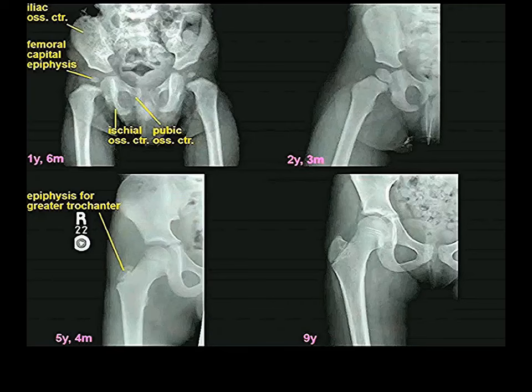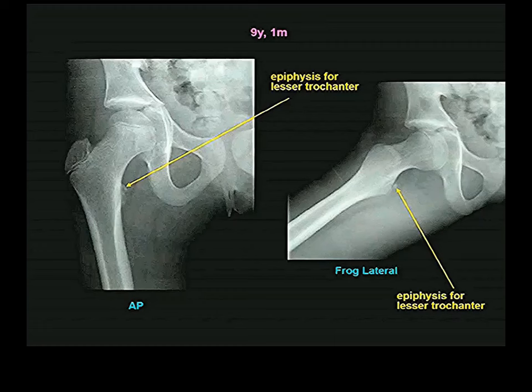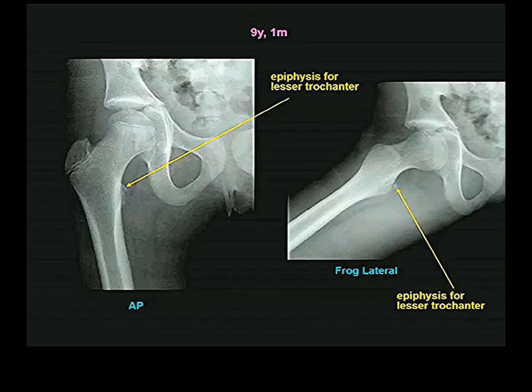Later in life we see the greater trochanteric epiphysis. At nine years of age, you can barely see the epiphyseal plate — this bone is starting to fuse. The femoral capital epiphysis is starting to fuse with the shaft, while the greater trochanter epiphysis is still not fused. There is also a small epiphysis for the lesser trochanter. So we have epiphyses for the femoral head, the greater trochanter, and the lesser trochanter on the proximal side of the bone.